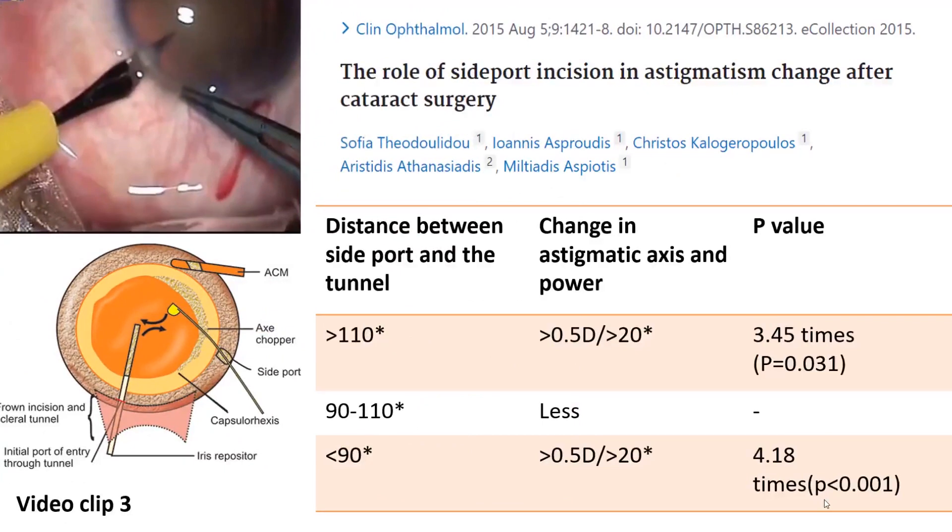Theodore Ledo et al. studied the role of side port incision in astigmatism change after small incision cataract surgery. For surgeons operating from the superior position, the authors proposed performing the side port incision at 90 to 110 degrees distance from the superior main incision, because cases with less than 90 degrees distance had 4.18 times greater likelihood of a change of more than 20 degrees of astigmatic axis and power.